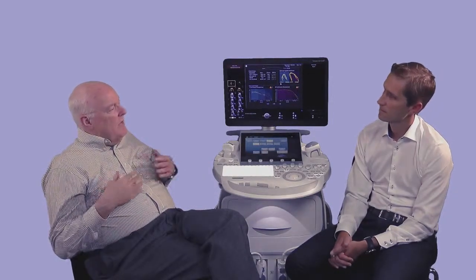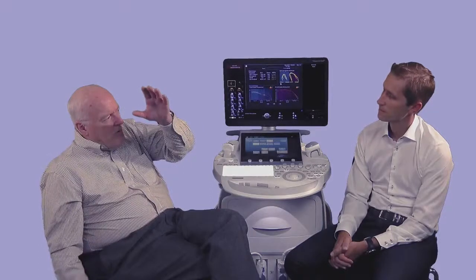And if you're in the Asian population, say, you may want to ask, well, maybe the Asian heart is different than the heart in Europe or North America. So it gives the investigator the opportunity to make measurements, have a whole data set of all these different measurements, even create their own nomograms if they want, and do their own research. Okay, so this really offers a huge playground, so to say, for future research activities.